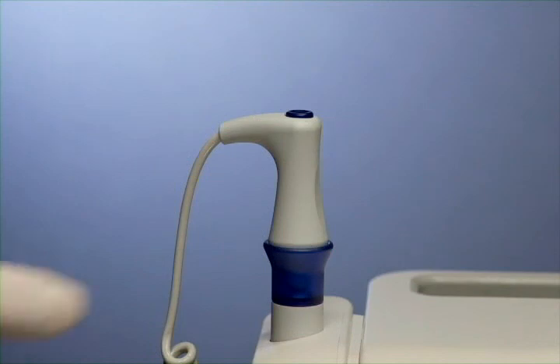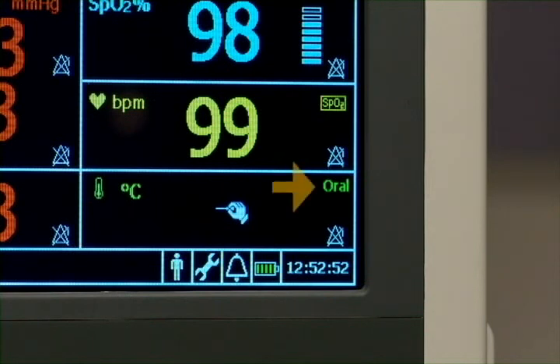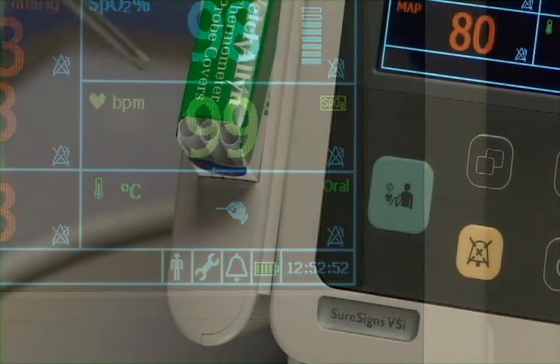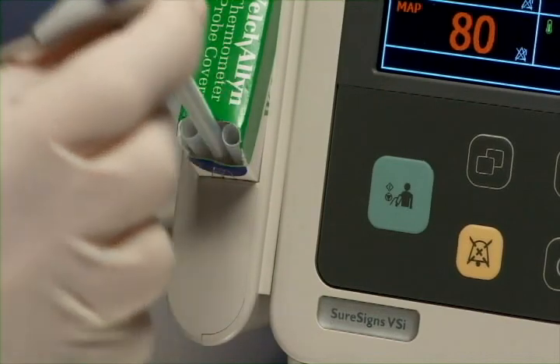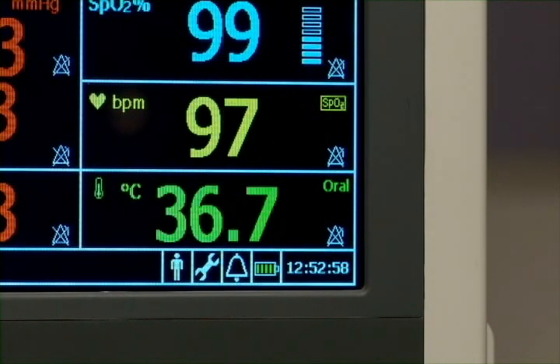In predictive mode, after removing the probe from its holder, an icon appears and a tone sounds indicating the probe is ready for placement. Make sure that the correct probe site is selected, and be sure to attach a probe cover before placing the probe. The VSI measures the patient's temperature in approximately 4 seconds when measuring orally and approximately 16 seconds when measuring axillary or rectally. An audible tone indicates that the measurement is complete.